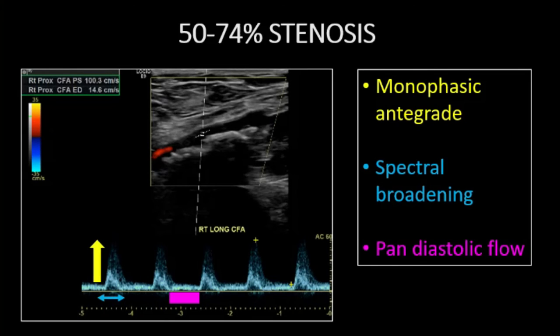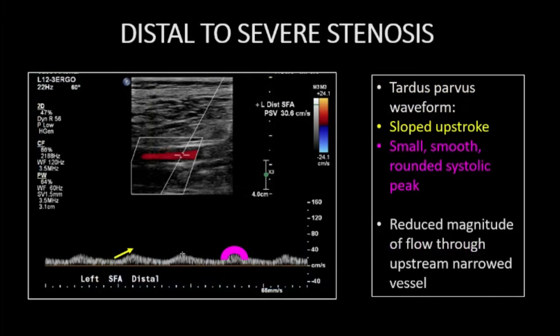This excellent case demonstrated both grayscale confirmation of extensive plaque with approximately 50% stenosis and a classic waveform showing monophasic antegrade flow, spectral broadening, and pandiastolic flow. This patient's extent of disease involved the external iliac through popliteal arteries with a nearly identical waveform in each segment.